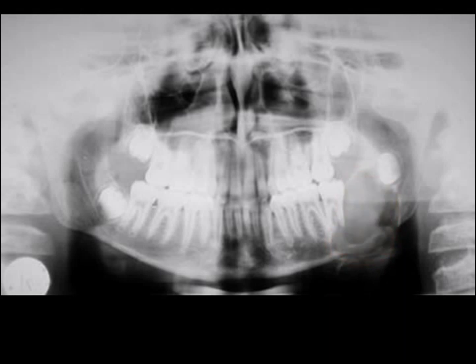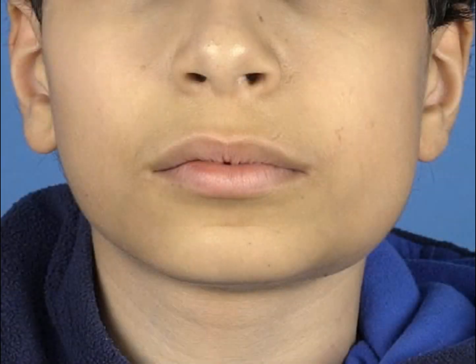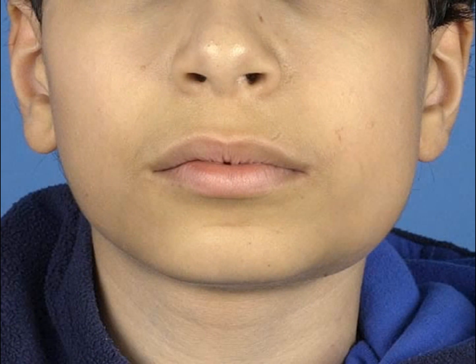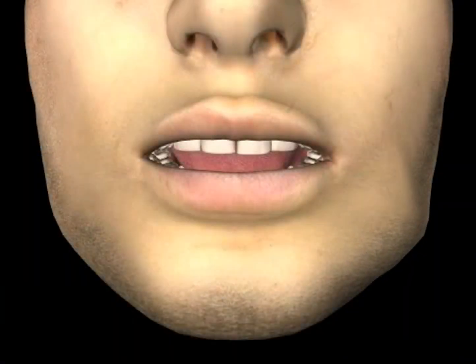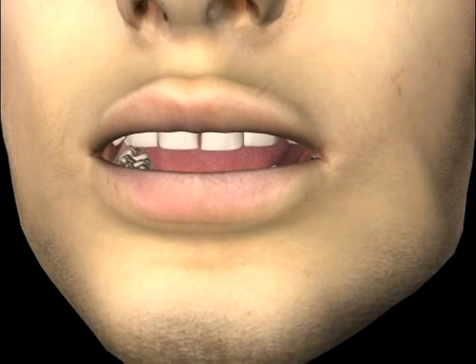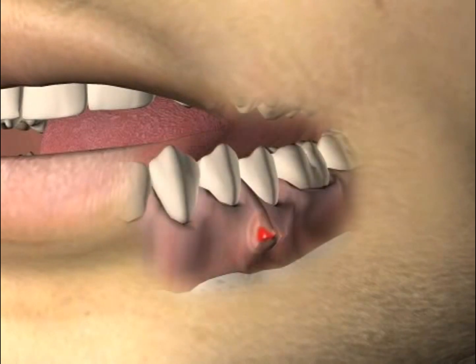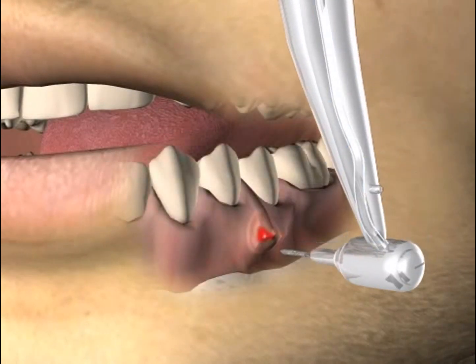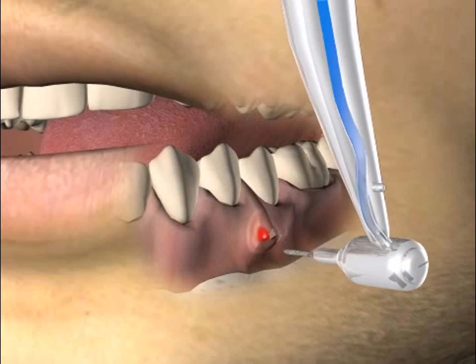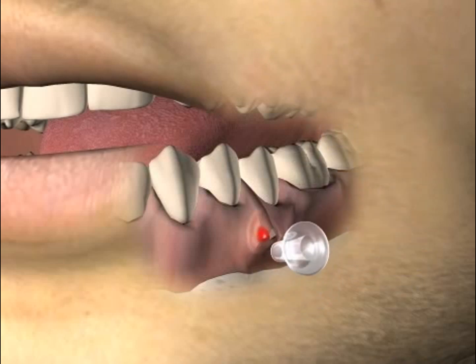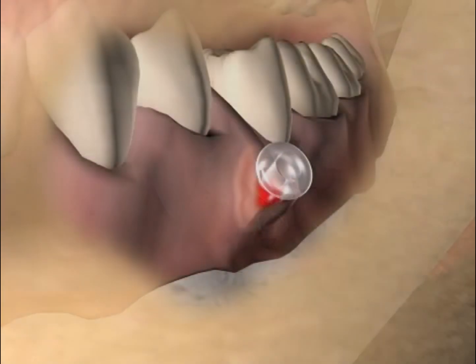The cyst is too large to be removed as the lower jaw could be broken. The size of the cyst can also be made out from the outside due to the deformed tissue. A cystostomy will first be carried out. A hole will be drilled in the cyst and a drain — in this case a tube — will be inserted which will communicate with the outside, in this case with the mouth cavity.